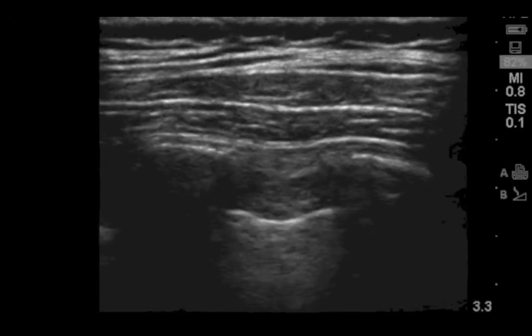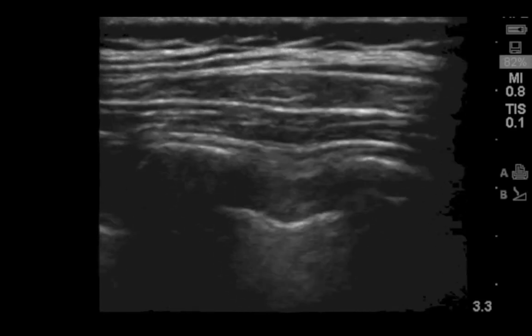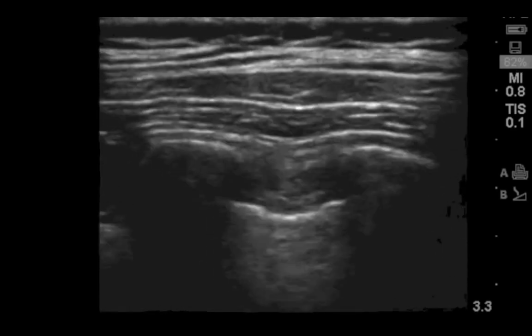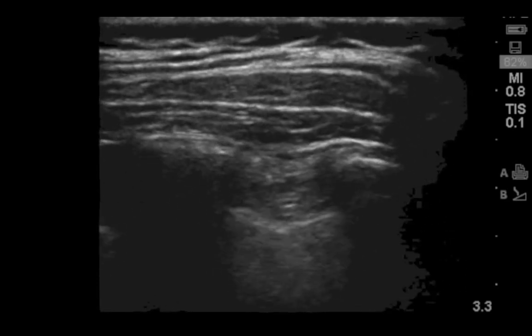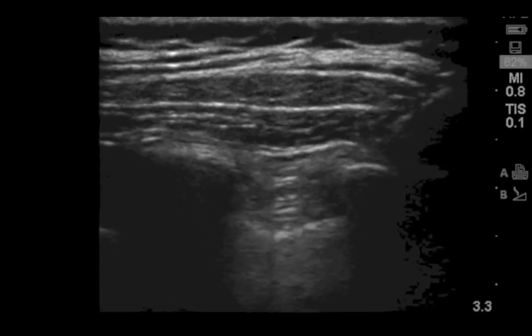This video demonstrates the thoracic paravertebral block. It's important to identify the landmarks, which are the transverse processes on either side of the screen with the bony dropout beneath them, and the bright white pleura with the lung beneath it. The needle is entering from a right to left direction. As it advances, you will see it pass the transverse process, go up off the process, and advance.